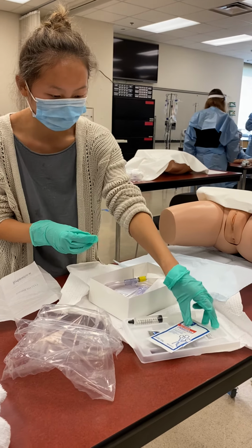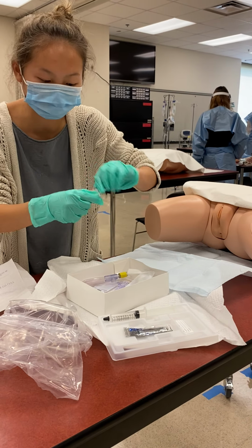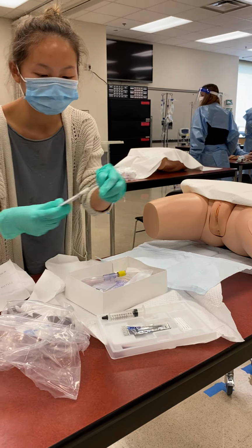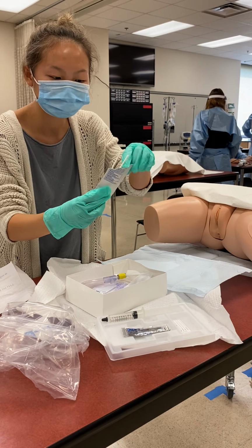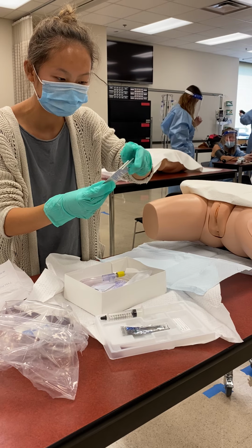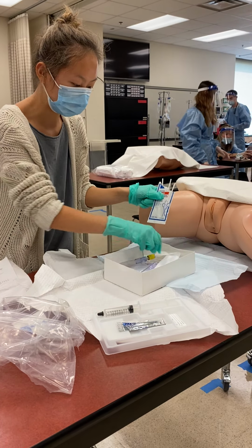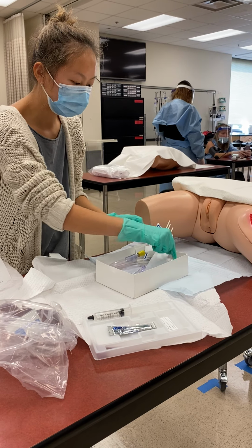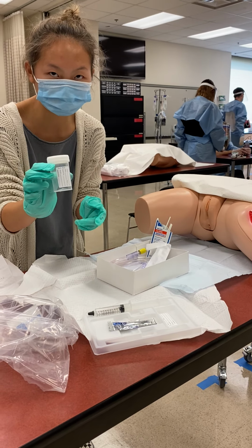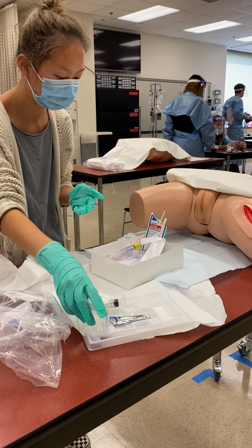So we want to set up our alcohol swab, so this will be easier for us when we're washing off the vagina. So we want to get our 3 sticks all situated. And so we can put this at the end over here. And so if we were collecting a urine specimen, we would put it into this container, but if not, we can just put this off to the side.